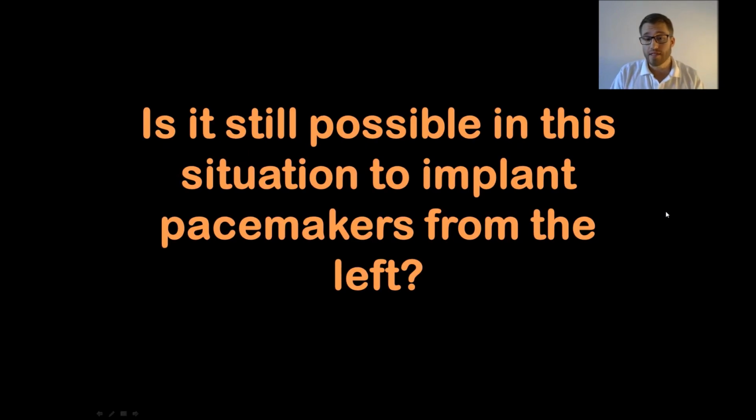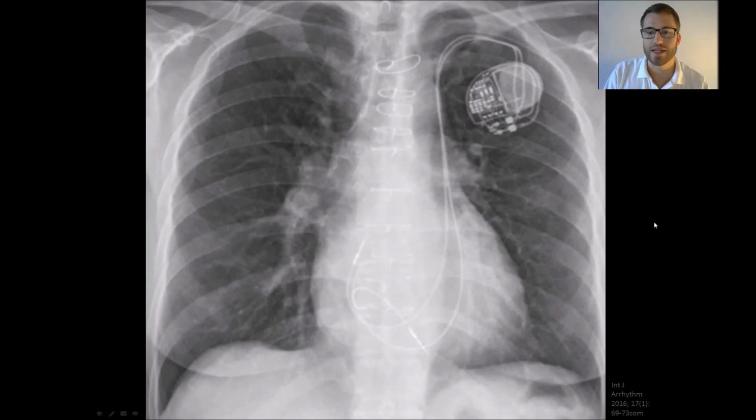And is it possible in this situation to implant pacemakers from the left? Well, in this case, the colleagues decided not to implant from the left side, where we normally would implant the pacemaker, and the pacemaker leads the typical way. But is it possible to do so? Yes, it is. Some colleagues are performing this.